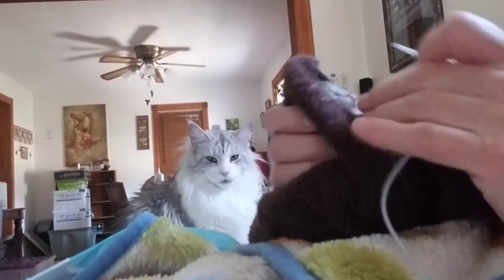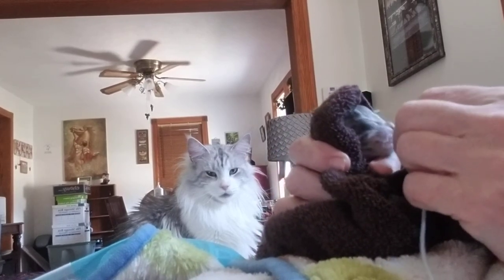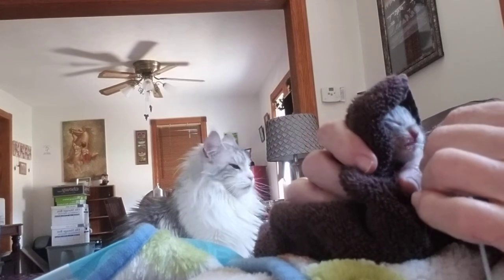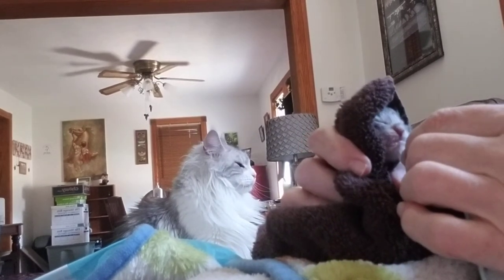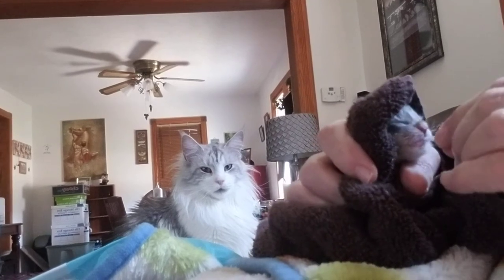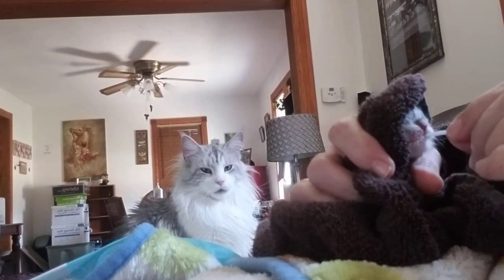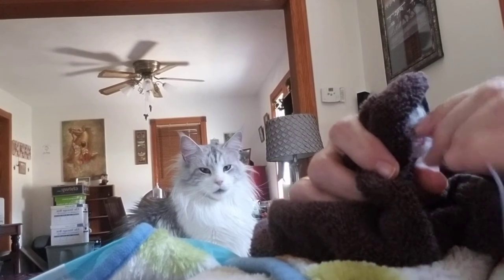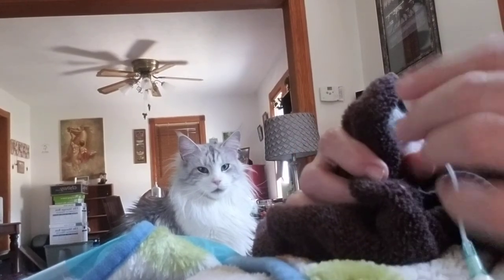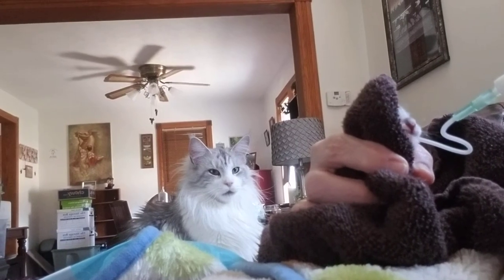All right, little one, come here. Yeah, put that in your mouth. And you want to try to go right center line, not to one side or the other. Help it to swallow it. Okay, we're just about there. Gently inserting it, very slowly and gently. And then once it's inserted to its spot, I'm going to give it a little bit of the formula.